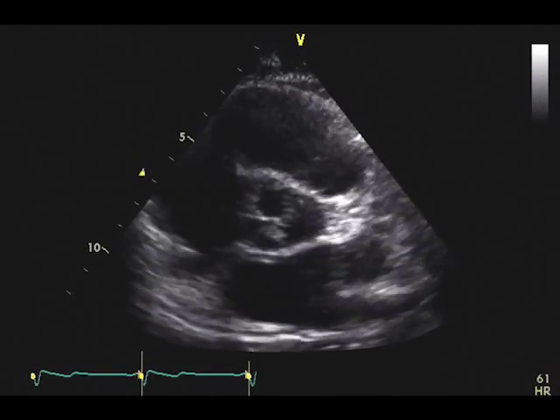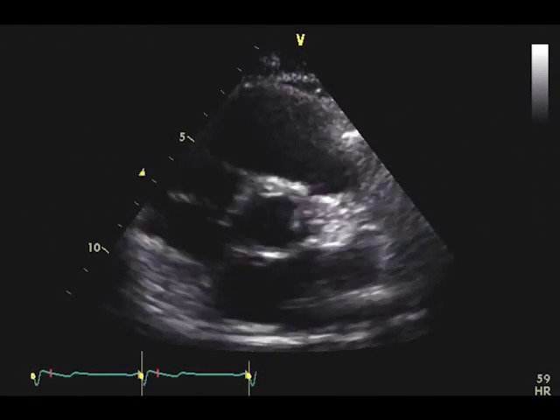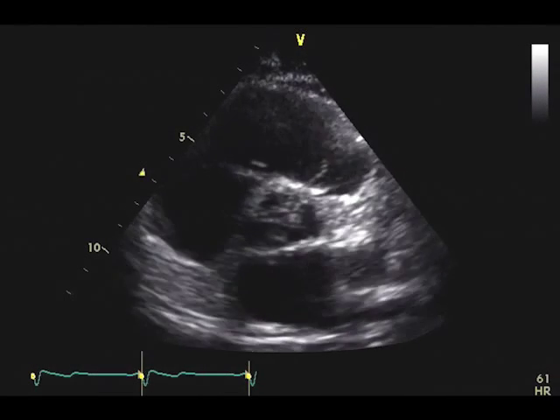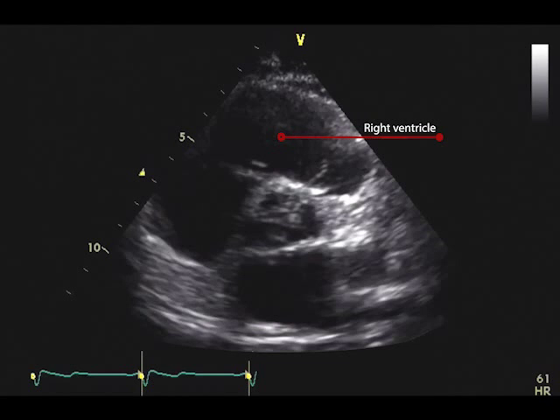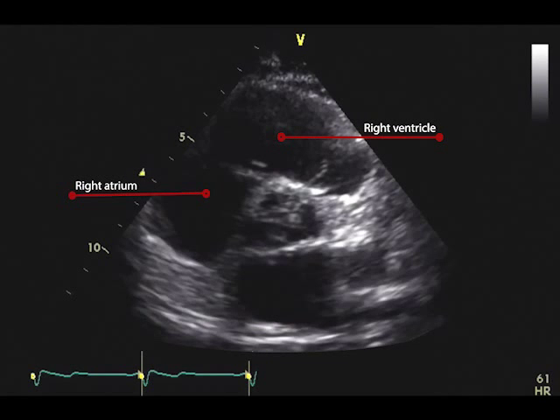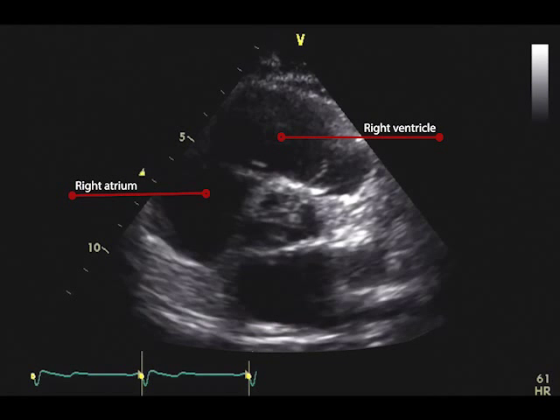The image shown here is taken from a healthy heart, but this view is extremely useful when assessing structural valvular abnormalities.